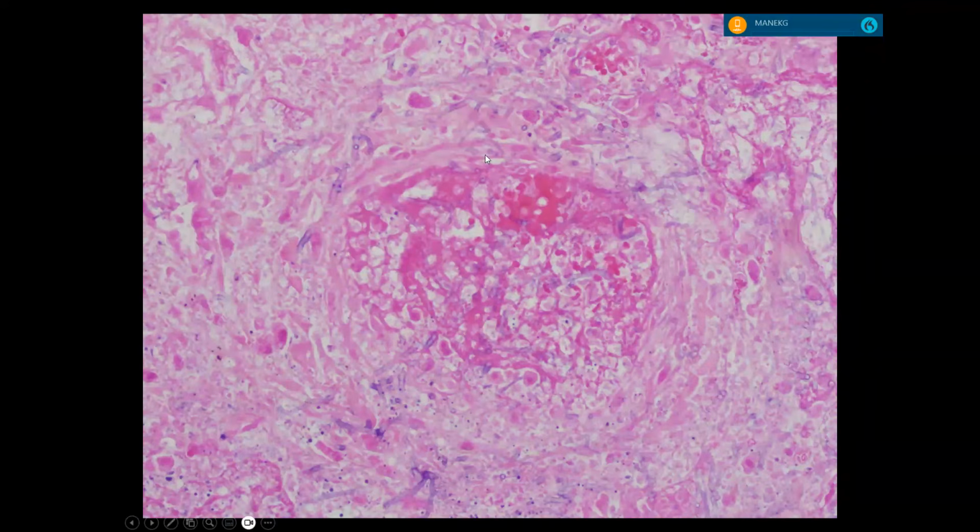Is this lung? This thing here? What is that? It's hard to see because the whole thing is necrotic. But this thing is like a blood vessel. It is an invasive pulmonary Aspergillus. That whole thing in the middle is an artery, and these things are breaking through the wall of it. See, like here.